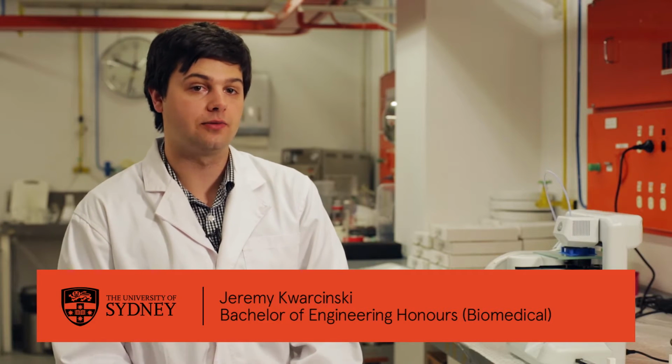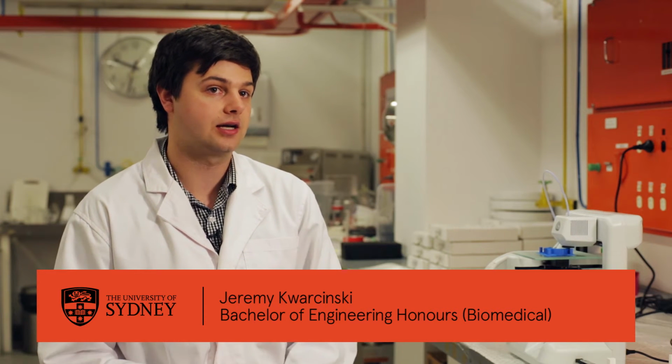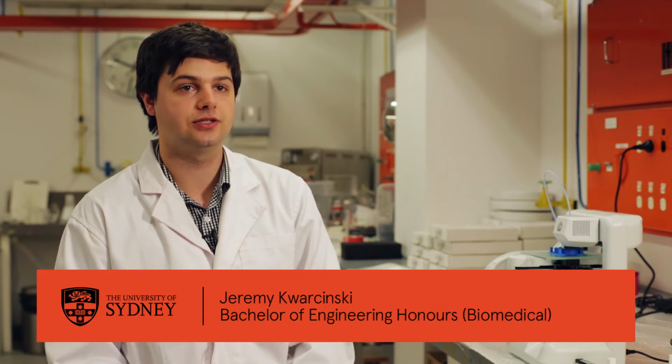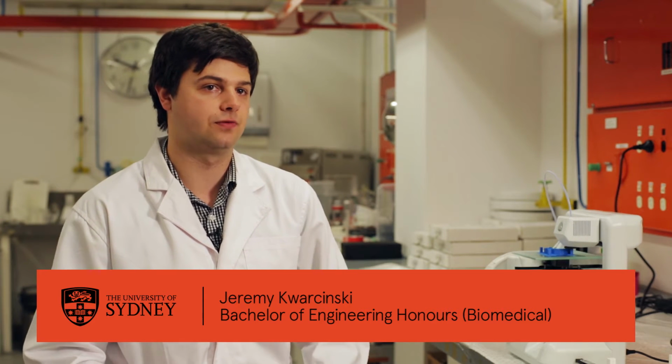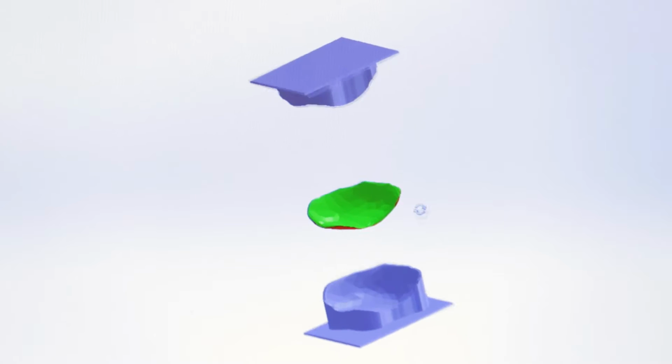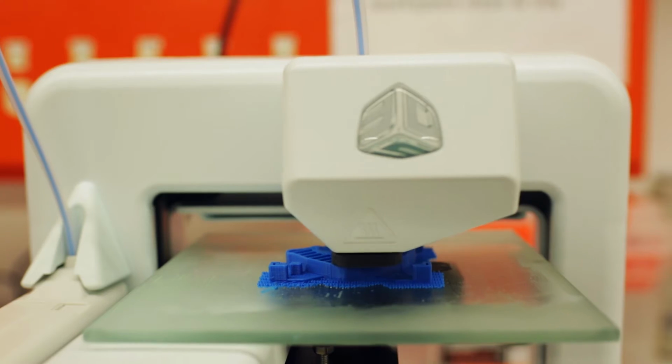So I'm working on a collaborative project involving University of Sydney students, academics and of course clinical technicians. And we're involved in creating patient-specific implants for skull injuries. We have developed a rapid templating technology which allows us to create patient-specific implants. Rapid templating is the creation of a two-part mold using 3D printing.